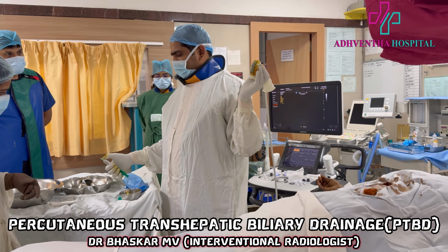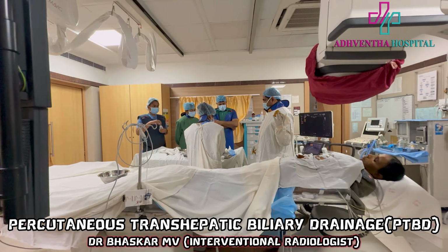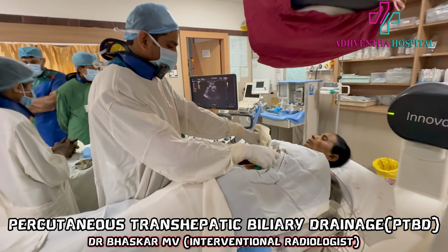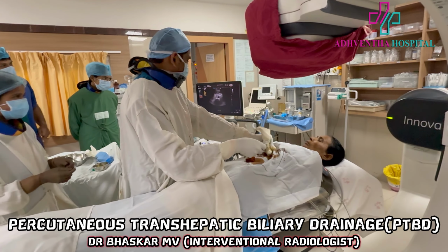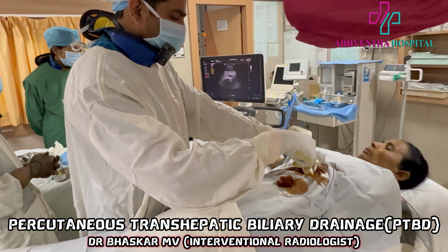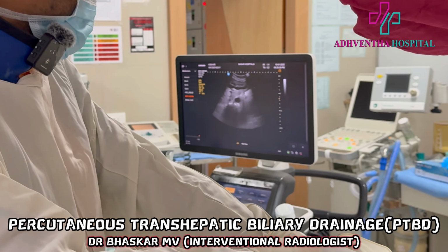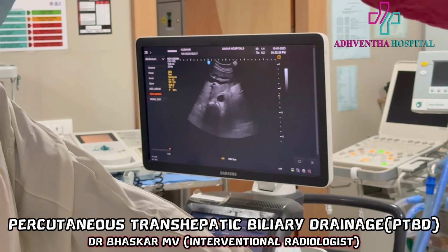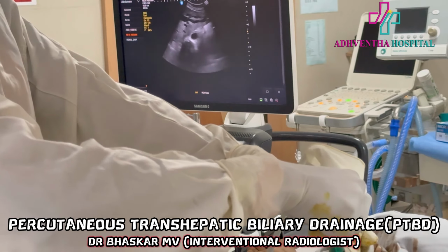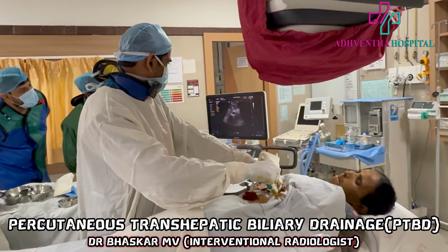Can I get a smaller gauge? The smaller one is to reduce the pain for her. So now I am puncturing under ultrasound guidance. Under the ultrasound guidance, I am puncturing the skin, subcutaneous tissue, and liver parenchyma there. So usually you can appreciate there some amount of fluid there.